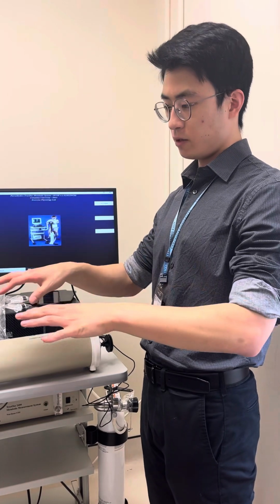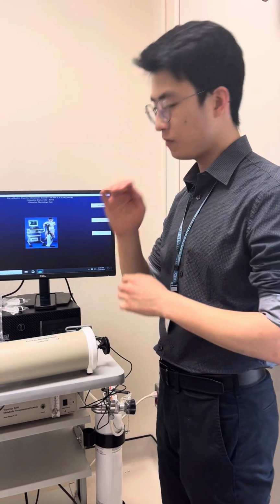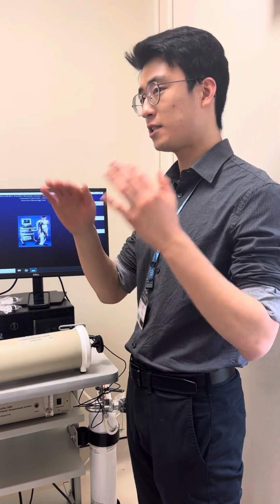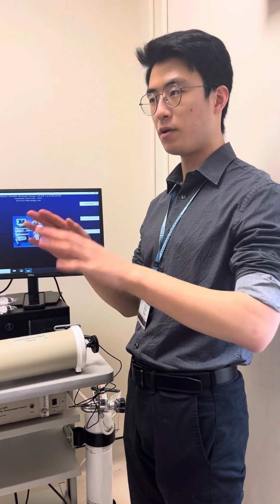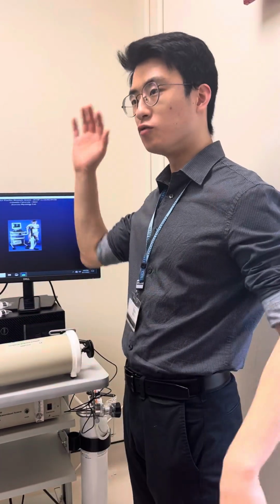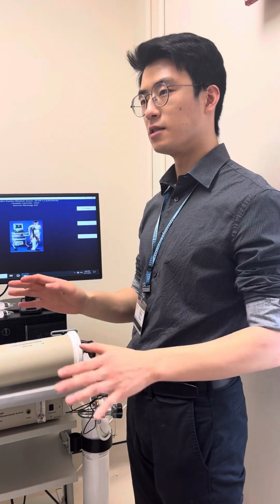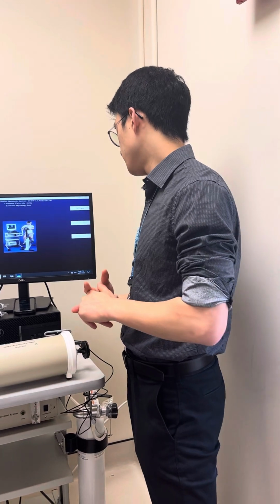Typically with the test that we're going to do, where it's very submaximal exercise, you may not see the respiratory exchange ratio rise at all. In fact, it may actually fall, and this is sometimes what happens when patients exercise. It has to do with a lot of things, but a little variation is normal. When it goes really out of whack, below 0.6 or above 1.0, then you should probably pay attention to that.